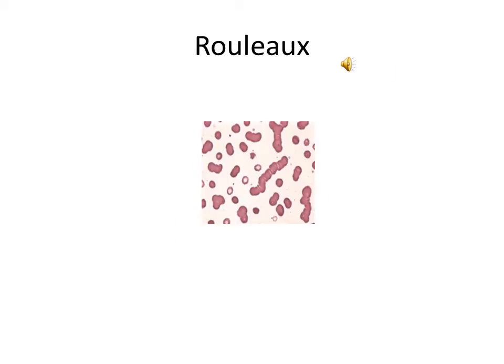You are looking at a picture of Rouleaux now, and you can see the red blood cells appear as stacks of coins. It's important when you observe the Rouleaux that you are in the sweet spot of the peripheral smear, as we will talk about in our 114 class. Because if you go to the thicker portion of the smear, they all start to look like Rouleaux, and that's false. That's just because the smear is too thick. This is considered Rouleaux when you are looking at the peripheral smear in the area where the red blood cells are just slightly touching.